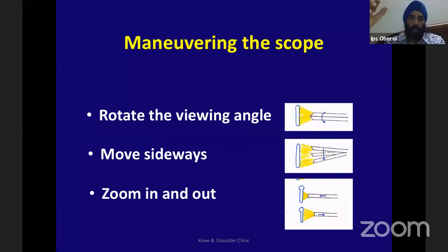It becomes too much inflated, the swollen or the soft tissue. They should not stop the water coming out. Yeah. So if it is, for example, suprapatellar pouch that has these problems, there you can put some cannula temporarily so that not too much water is flowing out everywhere.